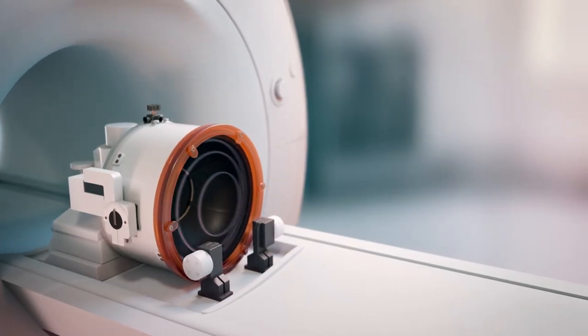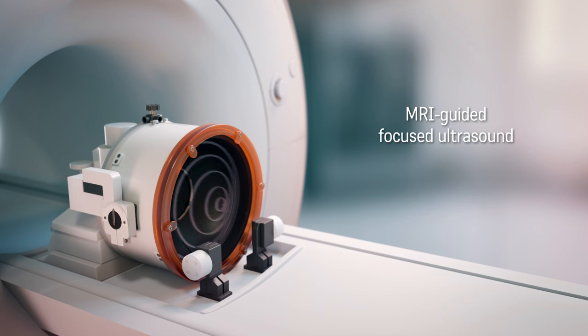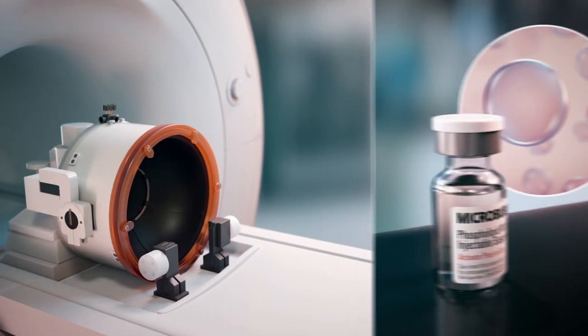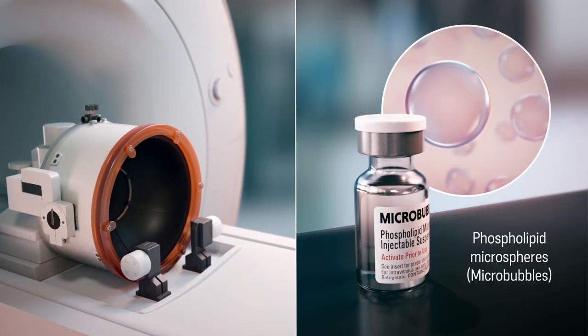This procedure requires the use of MRI-guided focused ultrasound and the intravenous administration of phospholipid microspheres, also known as micro-bubbles.